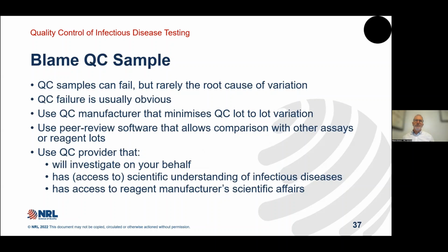It is often the case that QC samples are blamed where there is variation observed. QC samples can fail, but rarely are they the cause of variation. QC failure is usually pretty obvious.